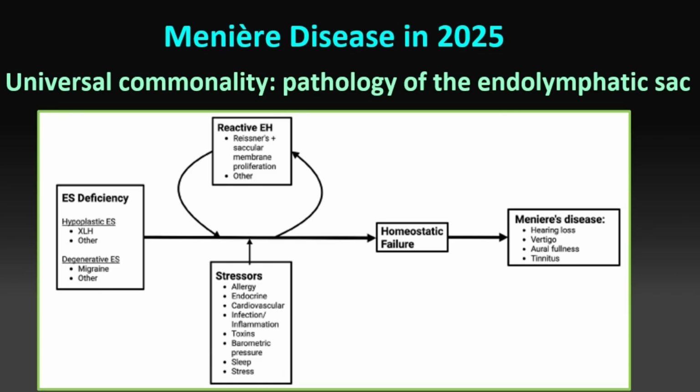And you can also inject through the ear itself, through the drum, and then it permeates through the round window and it gets in. So two ways, although now we usually do IV. And then in Japan, that really took off because the Japanese group, Naganawa, they really developed this and saw this in humans for the first time and put it in the context of imaging of the hydrops for Meniere's disease.